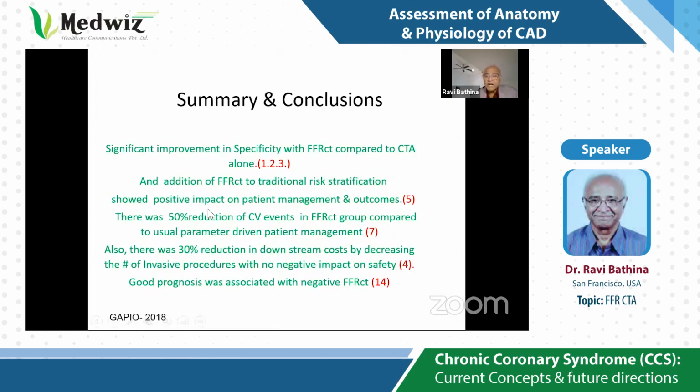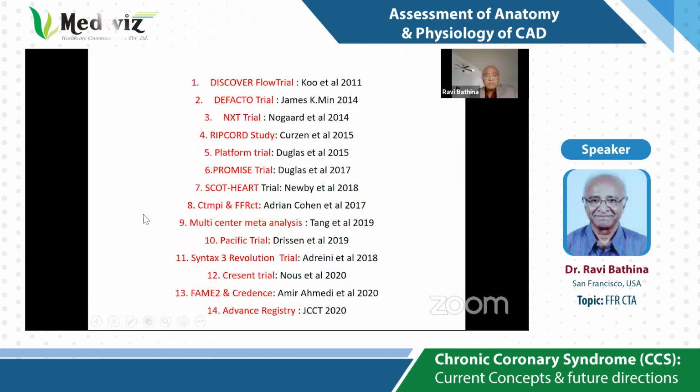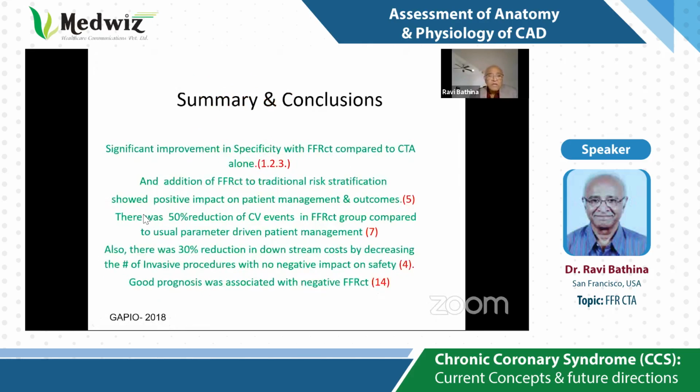Also, there was 30% reduction in downstream costs by decreasing the number of invasive procedures with no negative impact on the patient safety. Also, it's noted there is excellent prognosis with the negative FFR CT.